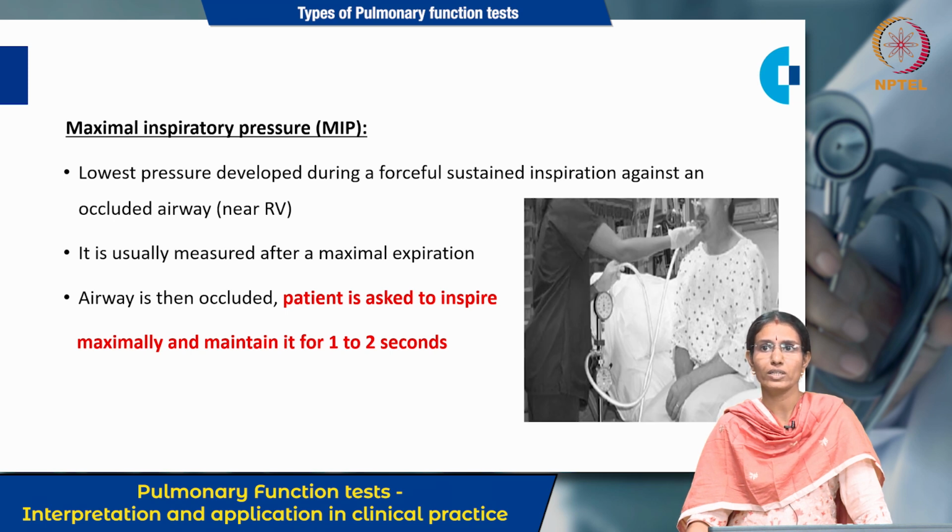So, this is how you can see the patient doing this maneuver. You can see the patient sitting with a nose clip and breathing through the mouthpiece, and this is connected to the pressure manometer to measure the inspiratory muscle strength, inspiratory muscle pressure. So, here this measures the inspiratory muscle strength.